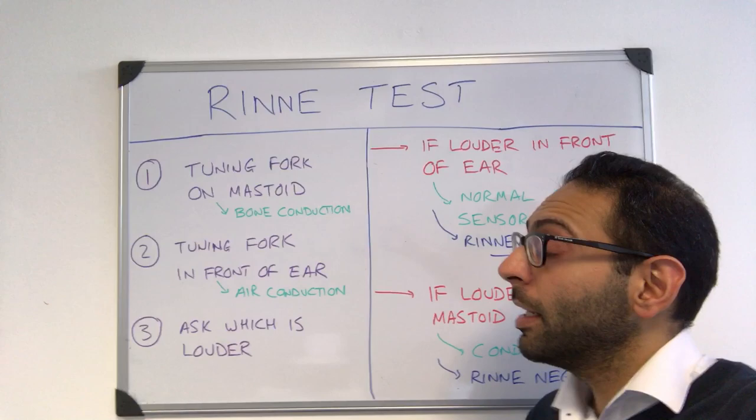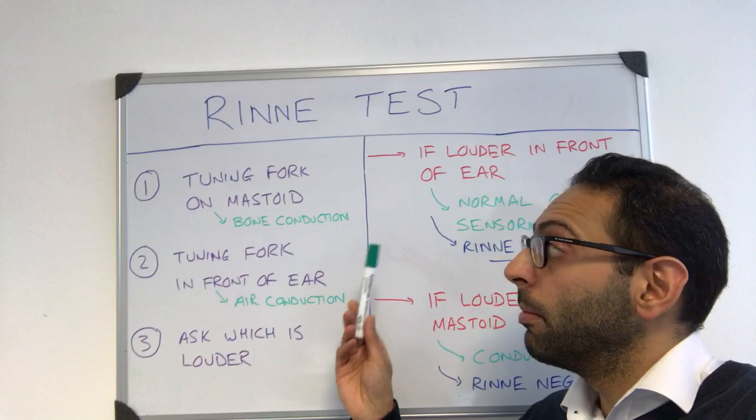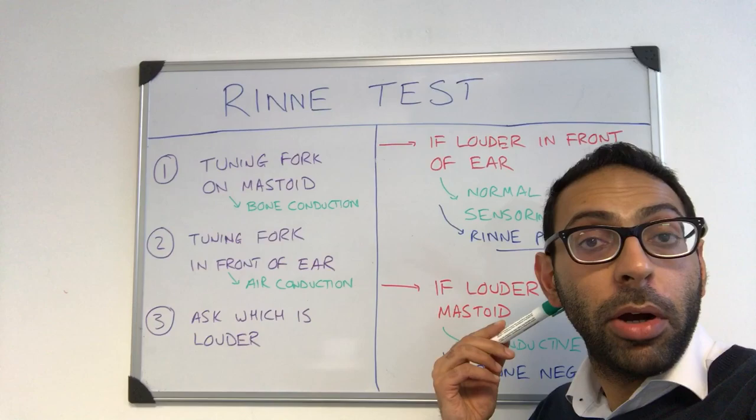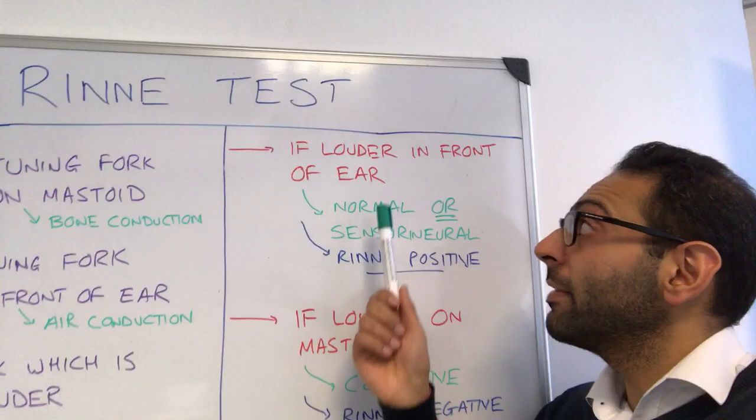There are three main steps to the Rinne test. You ping the tuning fork and number one, you put it on the mastoid bone at the back here — that's checking bone conduction. Number two, you ping it again and put it in front of the ear — that's checking air conduction. And number three, you ask the patient which one they hear louder: is it bone at the back or air at the front?